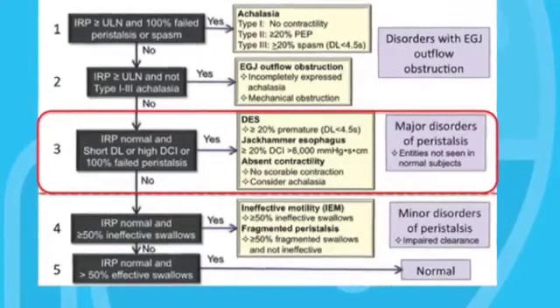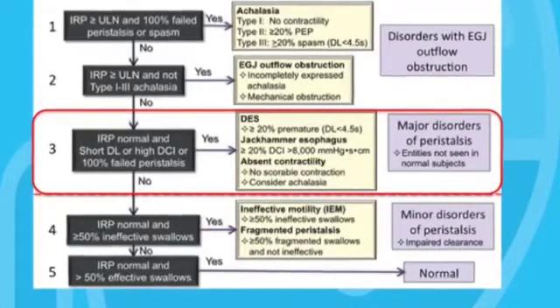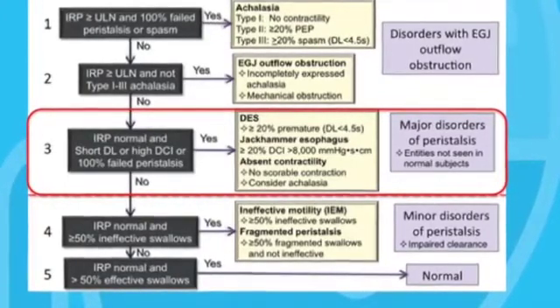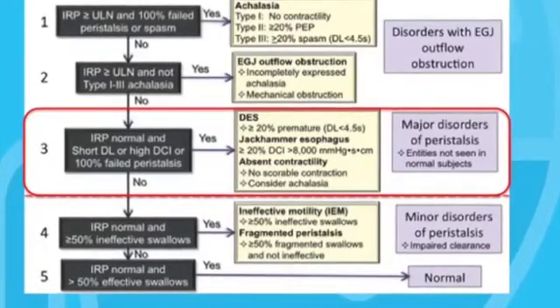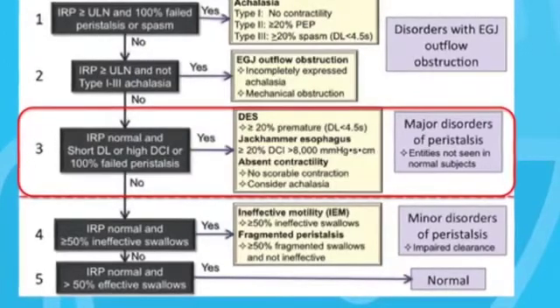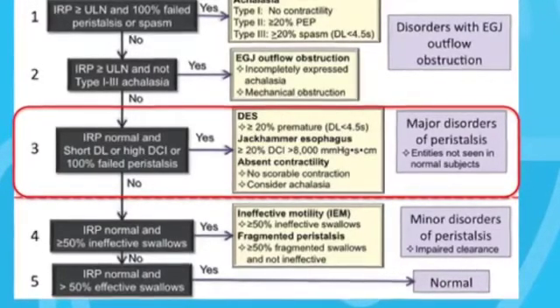It turns out that using these diagnostic criteria is a very poor discriminator between normal asymptomatic patients and patients with esophageal symptoms. A better term to use today would be hypertensive peristalsis, which reflects abnormal elevations in the DCI between 5 and 8,000. However, I should also point out that in the literature even today and also clinically, you will still see the term nutcracker esophagus used for historical reasons. More research is needed to know what degree of DCI elevation is predictive of esophageal symptoms related to hypertensive peristalsis.